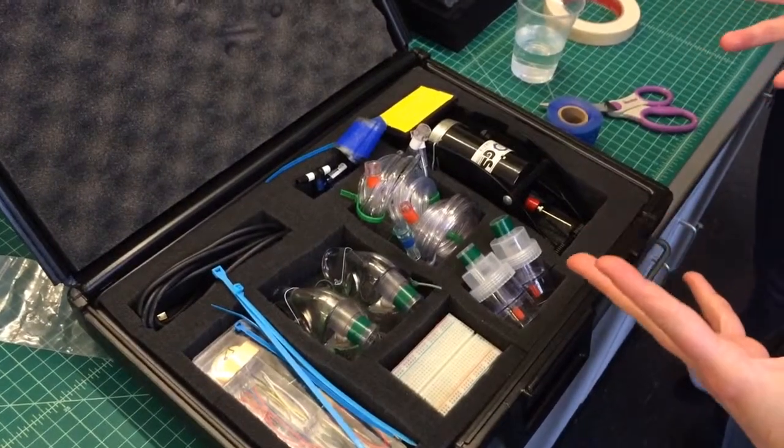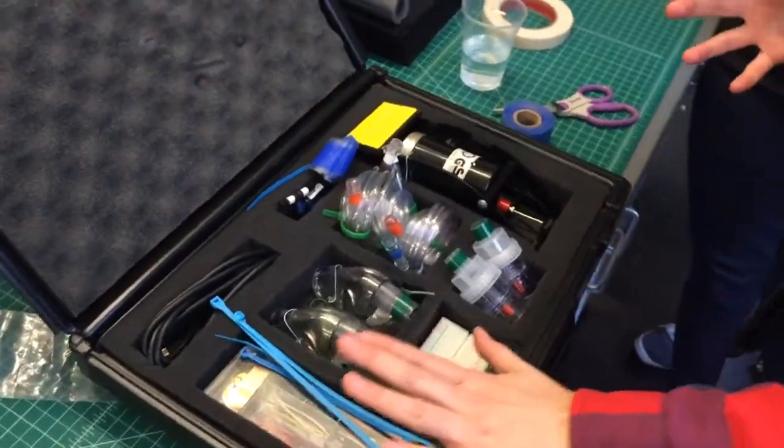In aggregate, the electronic components are about $30, and the nebulizer and the bike pump itself are about $10 to $12, depending on where you get them.